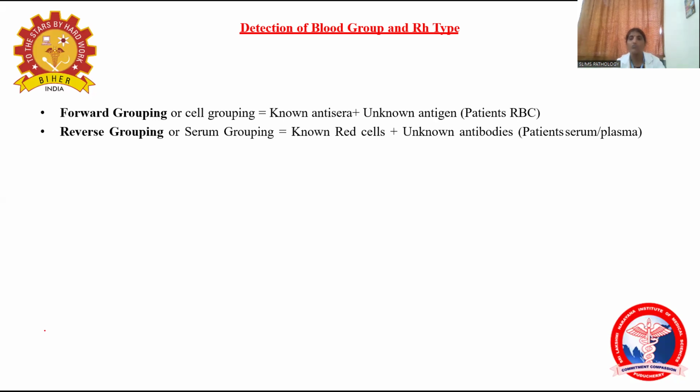This is just to reassure or to rule out any discrepancy in the patient's sampling technique or change of blood samples in the ward, right? For example, they send a patient sample, and instead of two, only one sample has been sent.